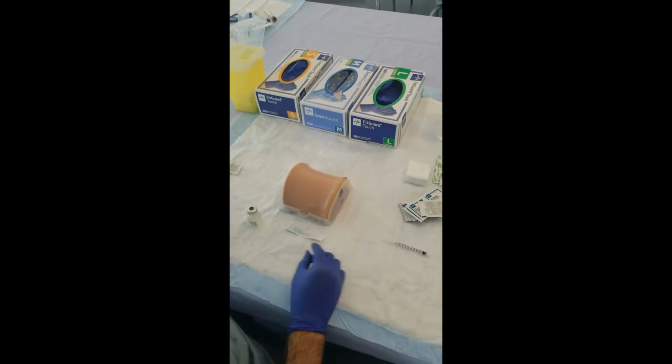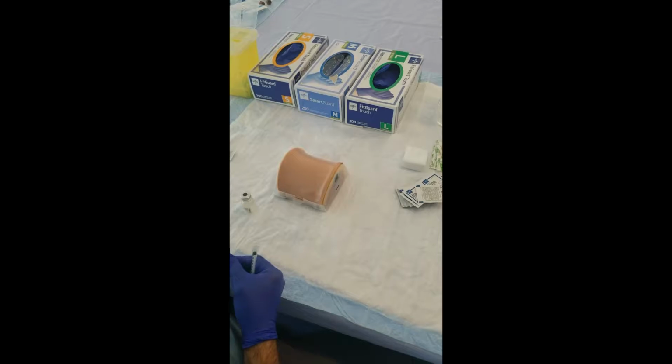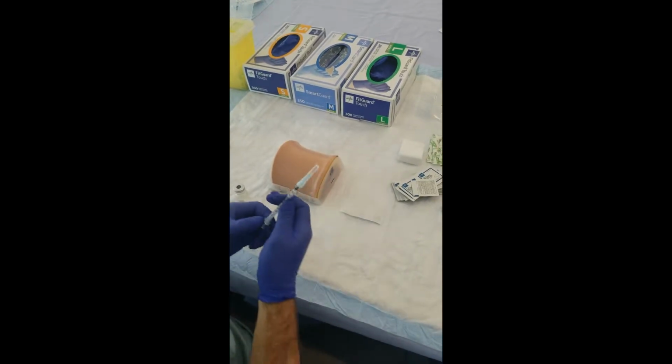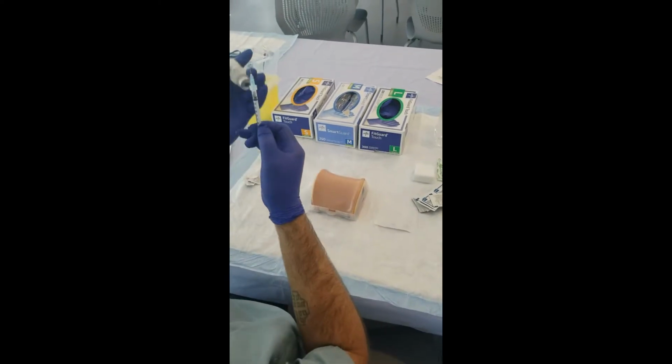Step 8, withdrew correct volume of medication, 0.1 cc, and removed air from syringe. It is helpful to first inject 0.1 cc air into the vial, then draw up the medication.